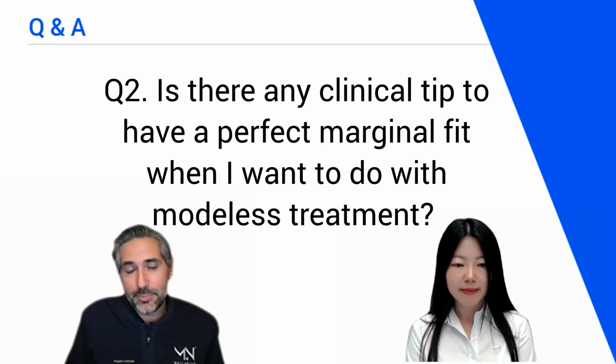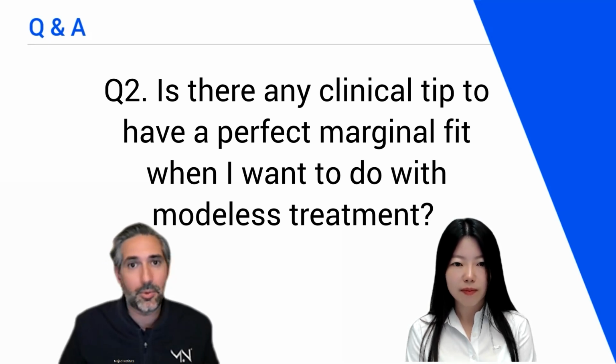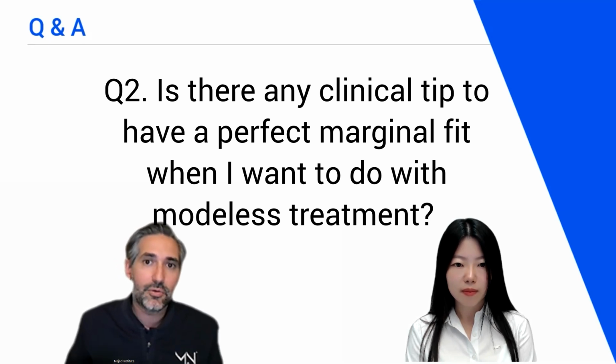First of all, me personally, whether it's 3D printed or milled, I am a huge fan of having fail safes and backups and quality checks. So I will never do fully modelless, but what I have gotten comfortable with is not checking occlusion, but I want to check the contacts, the marginal fit, etc. I don't skip the model on most cases unless it's a one visit, same day case, in which case the patient's going to be my model and I'll check in their mouth. But for any case that's not done in the same day, I prefer to have the models.